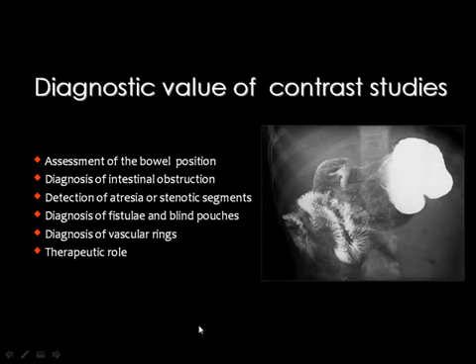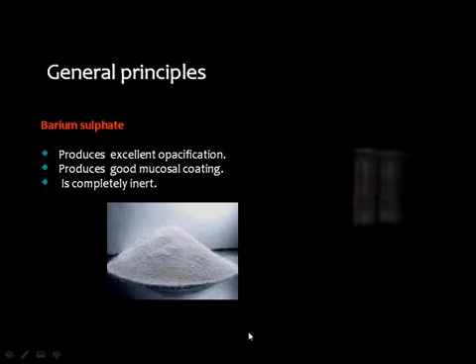The value of the contrast studies will be directed for assessment of the position of the bowel for cases of malrotation, diagnosis of intestinal obstruction, diagnosis of atresia and stenotic segments, diagnosis of fistulae and blind pouches, diagnosis of vascular rings, and some of the therapeutic role.